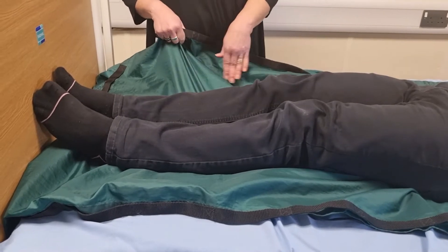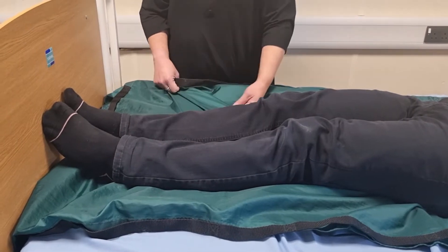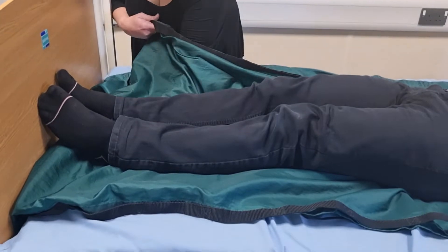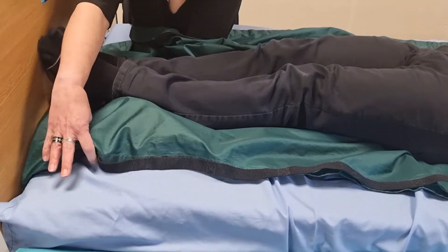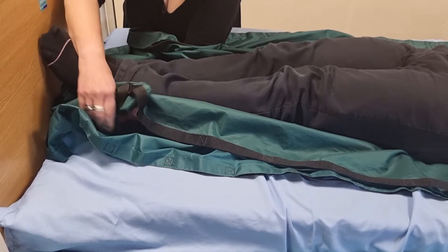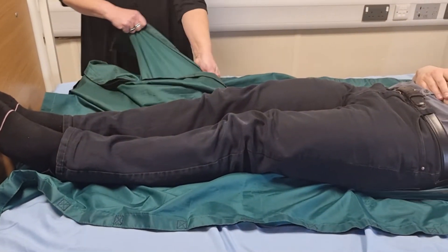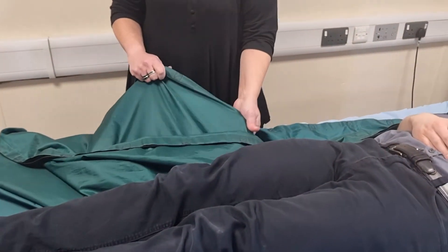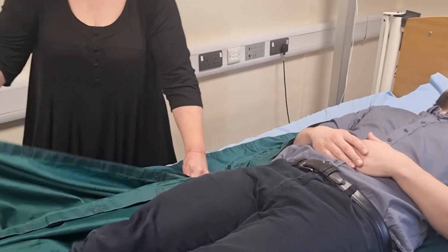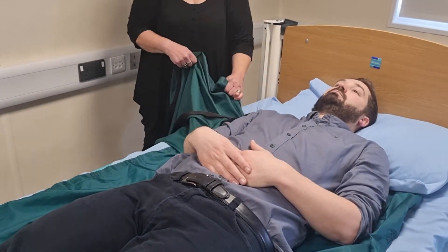What you need to do is find a natural curve of the person's body — that might be behind the knee or the ankle — and put your hand in between the slide sheets, go under that natural curve, then take the top slide sheet, fold that corner under itself, and then pull it through. What we're actually doing is pulling the opposite edge of the slide sheet to remove it from under the person.